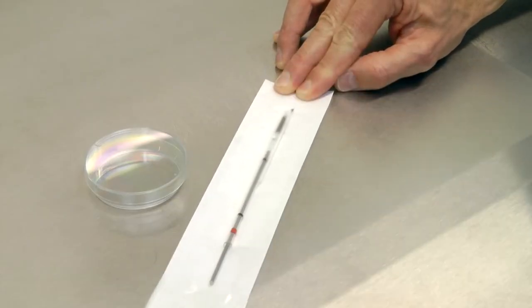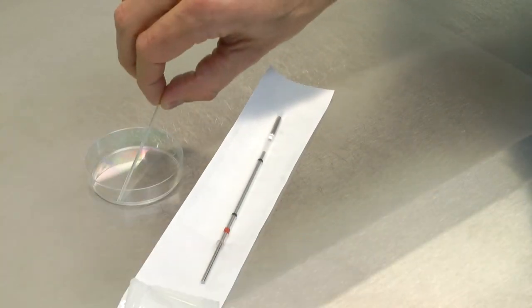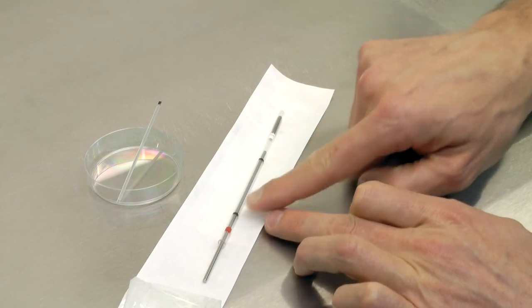When you open the pouch, place the RapidEye inside a sterile dish and label the straw in between the two black lines.